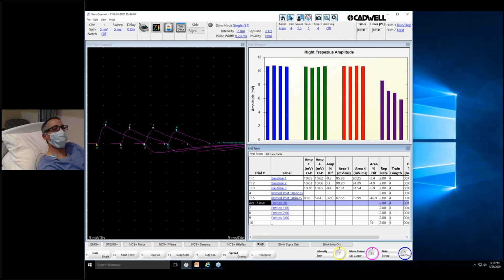If I was looking at that, I would still raise a suspicion if I just looked at that one set without the other three, that there's the biggest drop between shock 1 and 2, and then a little bit less, but then a bigger drop between 3 and 4. And that should be a little clue that there's a technical problem. It should be more of almost a U-shaped or a ski slope shaped. And so that suggests that there might be a technical problem.